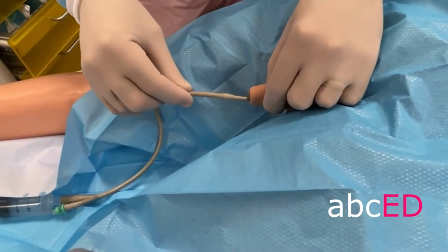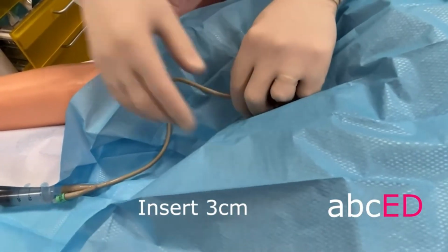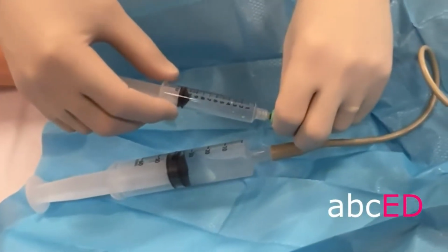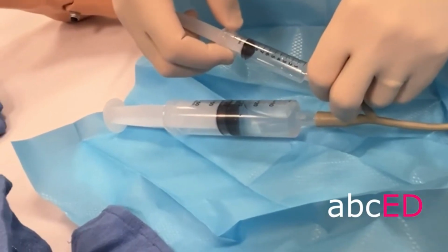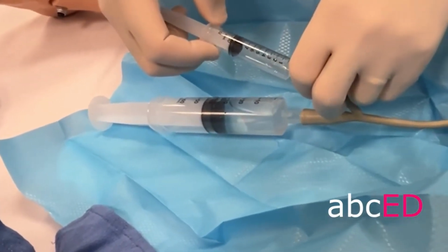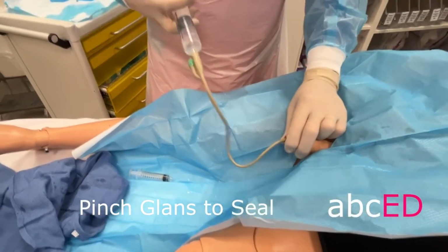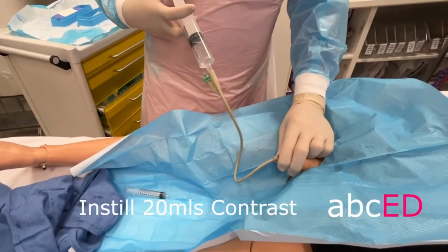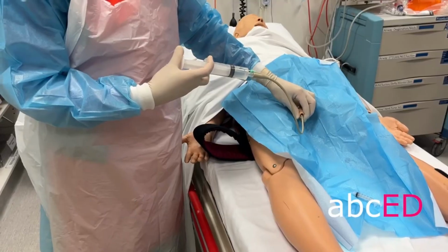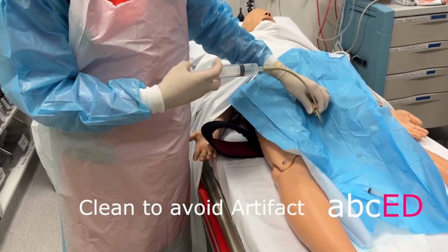Insert the catheter into the meatus 3 centimetres. Gently inflate the balloon up to 3 mils or up to the point where the patient experiences discomfort. Pinching the glans to create a tight seal, slowly instill 20 mils of contrast. Be careful to mop up any leaks to avoid artifact on the X-ray.